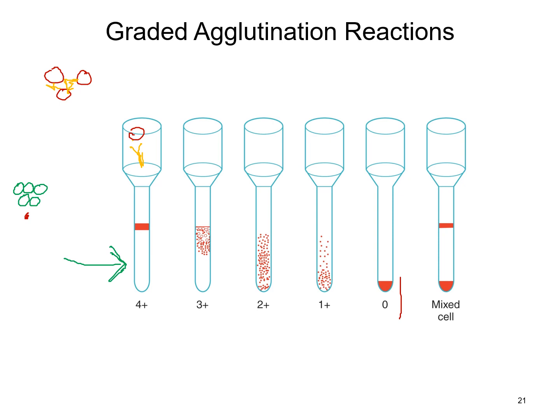However, if we have agglutination that takes place, you can obviously see that this whole entire complex will not go through that gel. So when it's spun, it's not able to be forced down through those gel particles. So you actually get that visual line across the top.